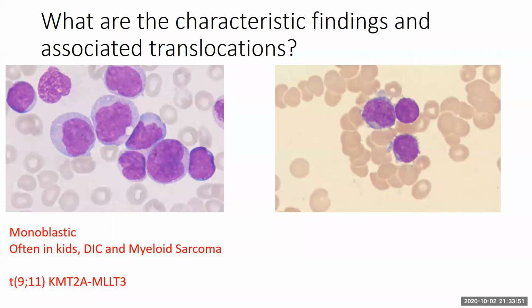The next one on the right here, you guys see this commonly occurs in kids, usually kids with Down syndrome. And what am I pointing out to you guys here? These are kind of very ugly cells that have these blebby cytoplasmic projections, almost like little pseudopod formation.